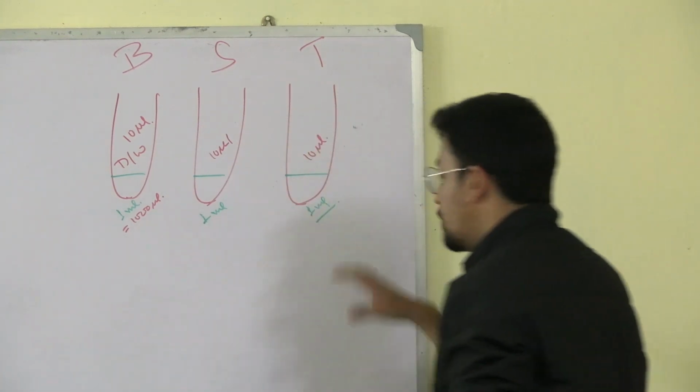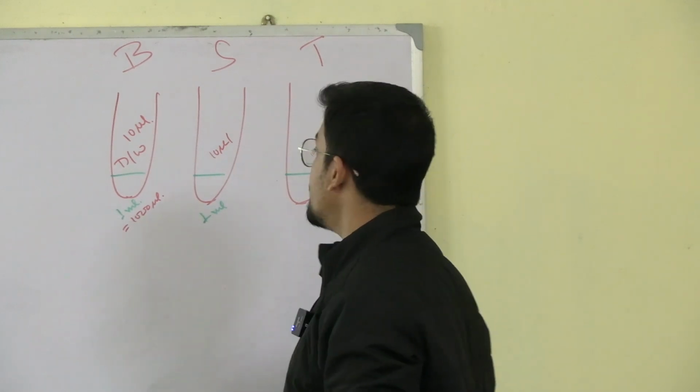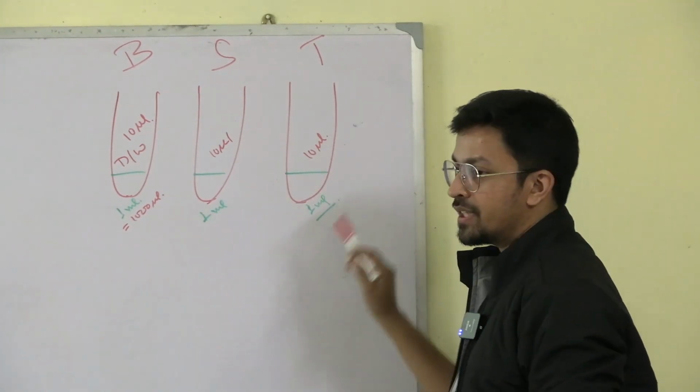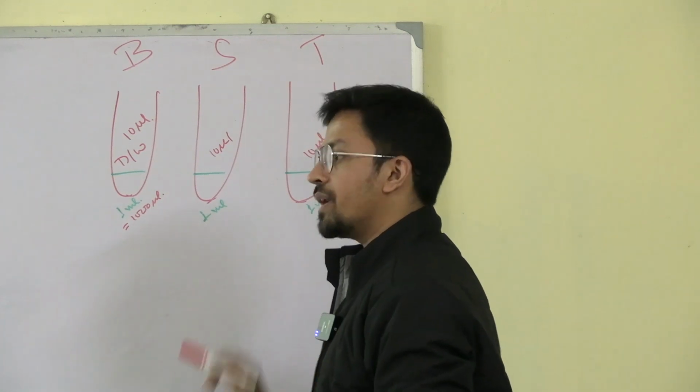Anywhere you put it and you keep it for 10 minutes. After 10 minutes what will happen? Some reaction will happen, and if the sample is containing glucose, then there will be some color change. That will be pink color.